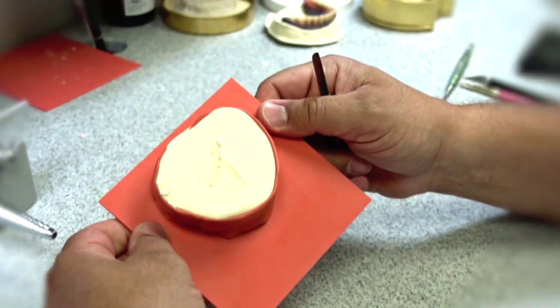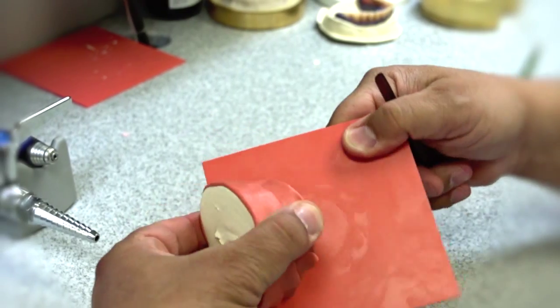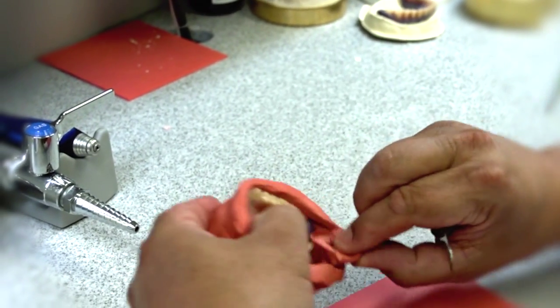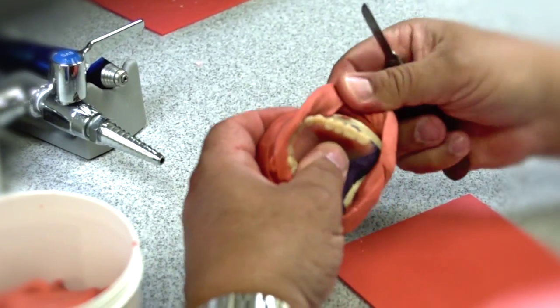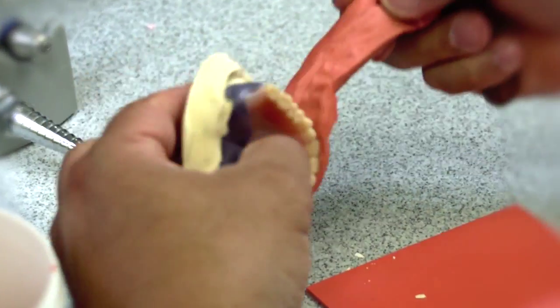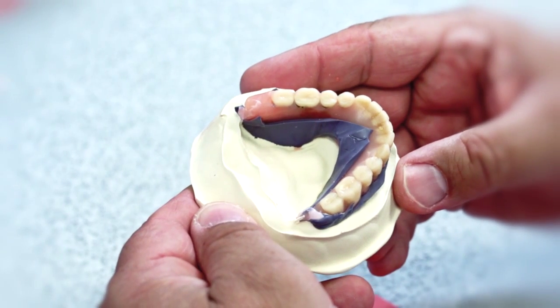Okay, the model has been poured, and I just want to show you how easy it is to take this material off. There's our base. That comes right off. We put it right back into the bucket. The silicone material comes right out, and look at how clean that is. The lower, nice even borders, and look at how smooth that tongue area is.